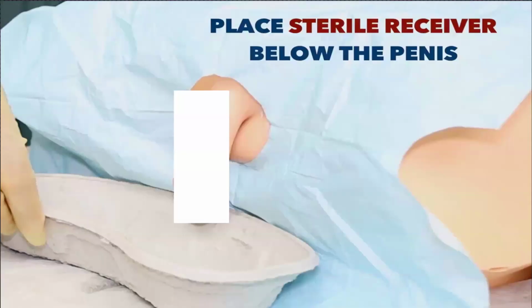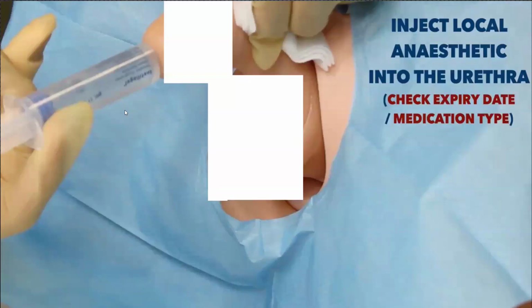Then you will place a sterile receiver below the penis. Then you will inject lidocaine gel inside the urethra for 3 reasons: lubricant, analgesia, and to check any obstruction.